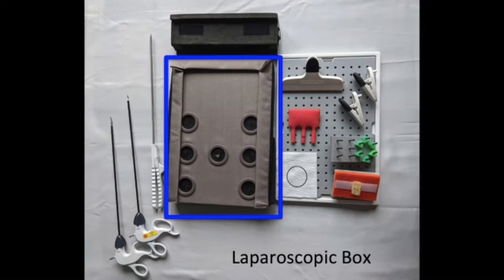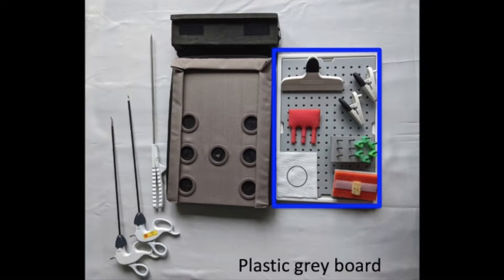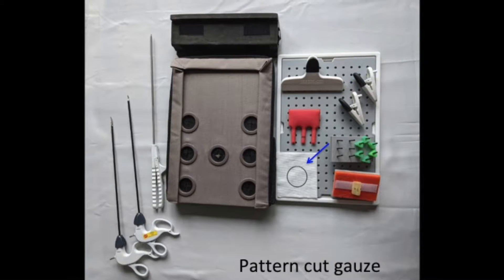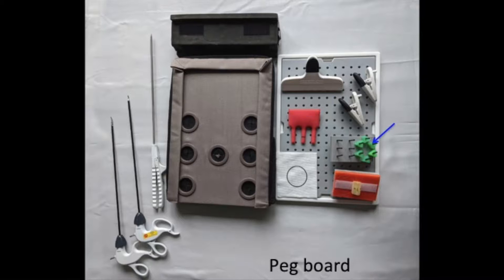For the box itself, you will need the laparoscopic box, the black block, and the grey plastic board. For the tasks, you will need three clips — a larger one and two smaller ones — along with the gauze with the circle for the precision cut exercise, the red foam for the ligating loop exercise, the pegboard with six pegs for the peg transfer exercise, and the suture pad with the Penrose for the knot tying exercises.